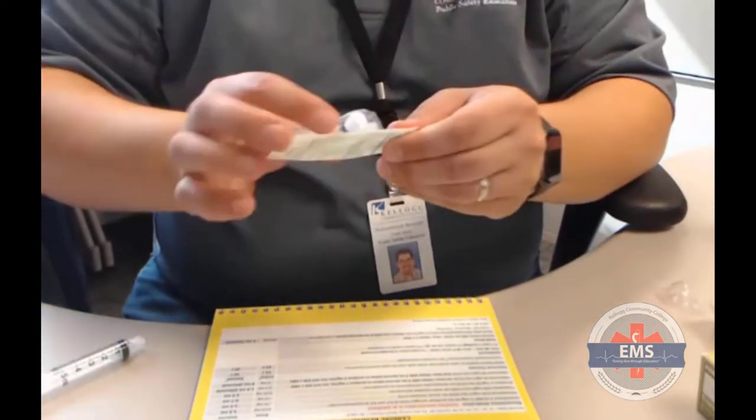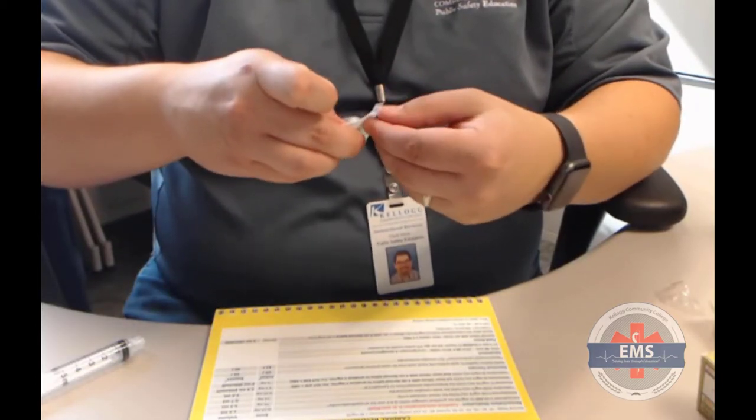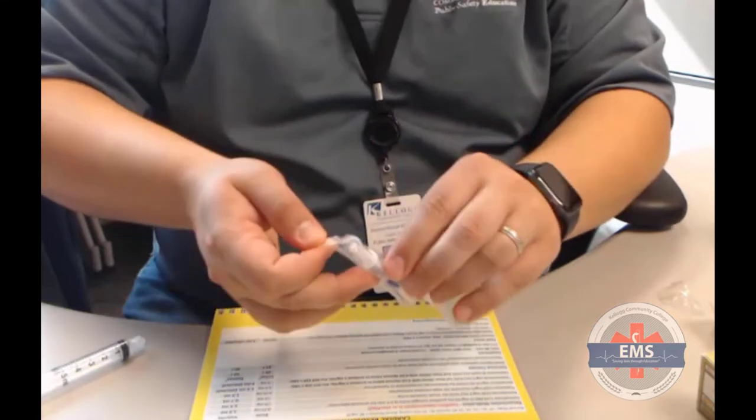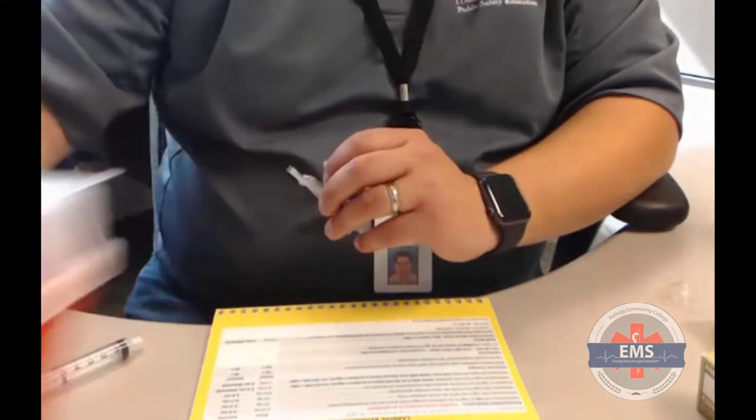I'm also going to have my 3-way stopcock, and this is going to be a great tool for helping me control the dosing on these patients. I would have the proper PPE on. I also, believe it or not, do have a sharps container here.